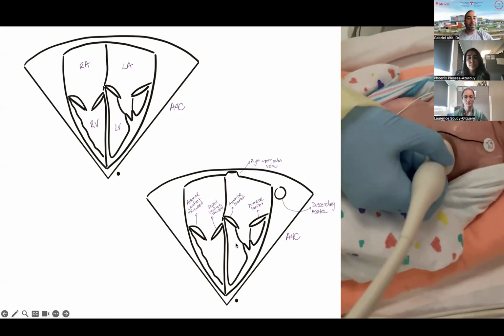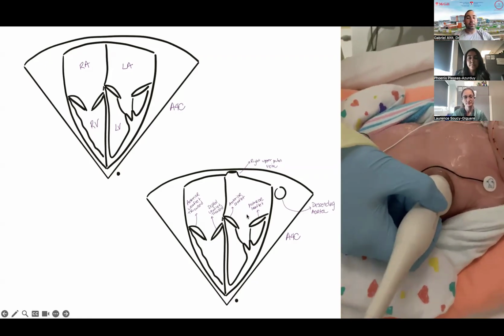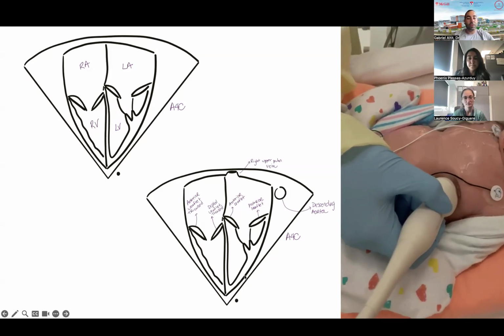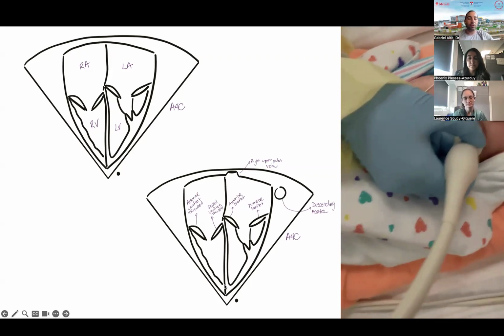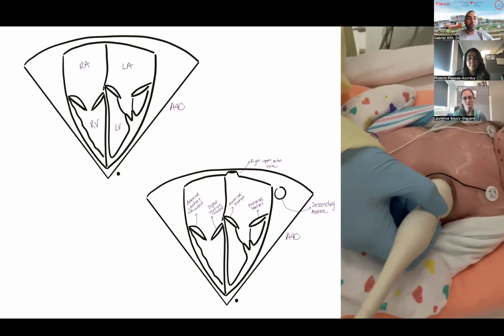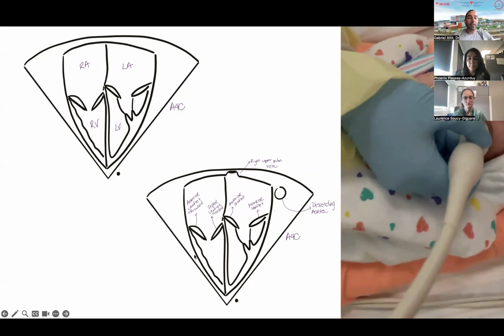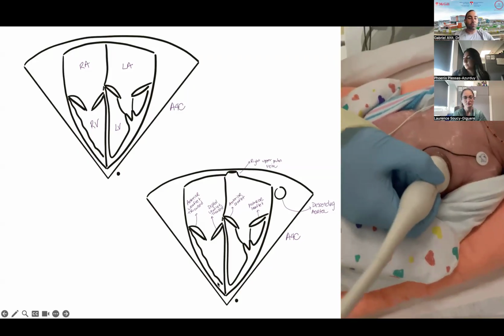So you'll see that in the segmentation, when we look at the LV anatomy and the different walls, we call this more of a posterior wall or more of an inferior wall. And this is the septal wall, which is slightly positioned anterior compared to this wall within the chest. And then you have the lateral wall of the right ventricle, which is one of the most contractile portions of the RV.